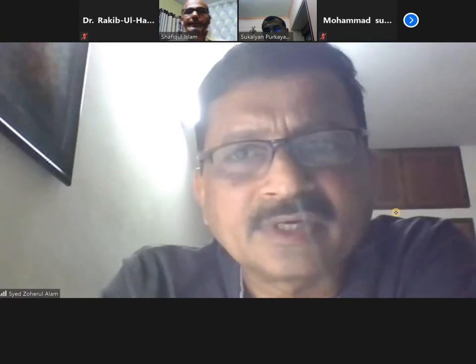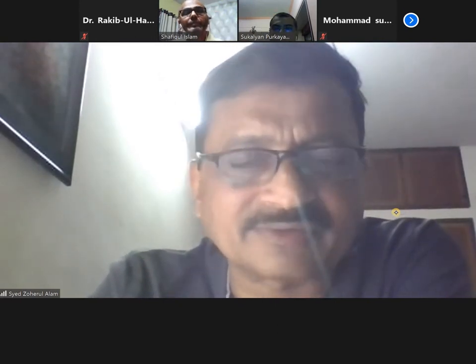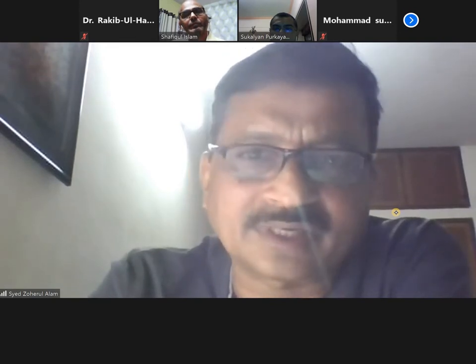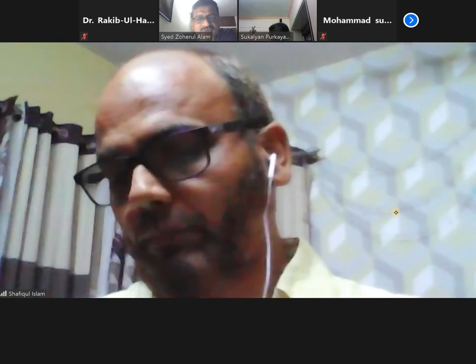Okay, thank you. And these second, third, fourth types are a little bit uncommon. So I think in case of second, third, or fourth type, one can use onyx.